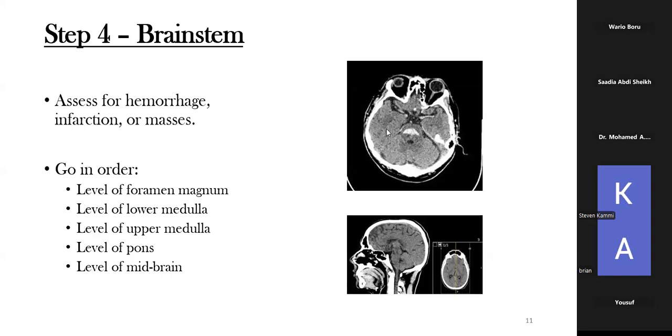Good. So next time, I think I'll include a normal CT so that we go through the different levels. But for a summary purpose, that's how I do it.